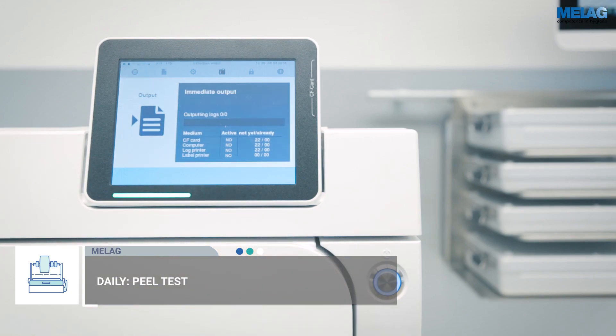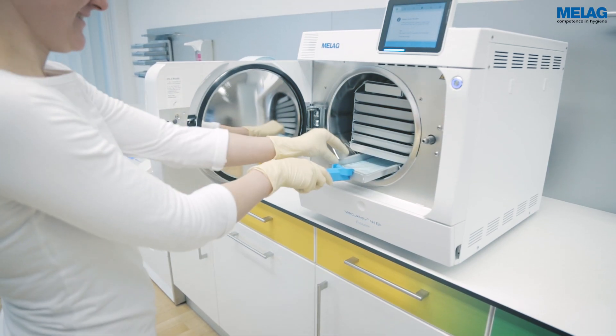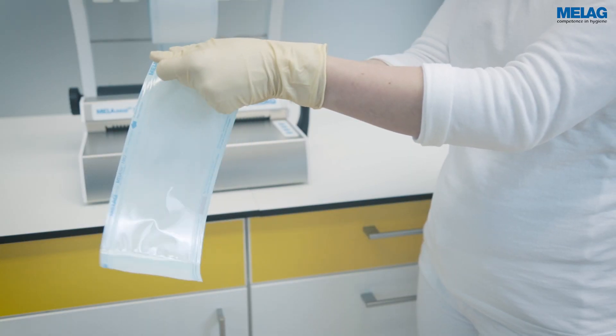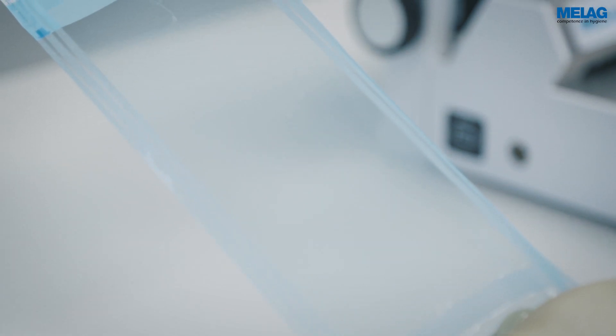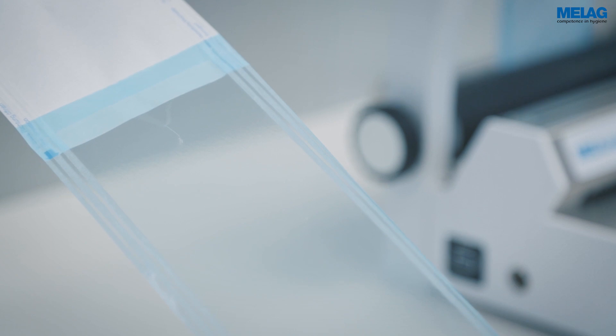To conduct this test, sterilize the sealed packaging. Take it from the steam sterilizer and pull the seal seam apart slowly in the peel direction. The force to open a properly sealed pouch has to be equal for all four seal seams. The paper should free itself from the foil, leaving almost no residue.